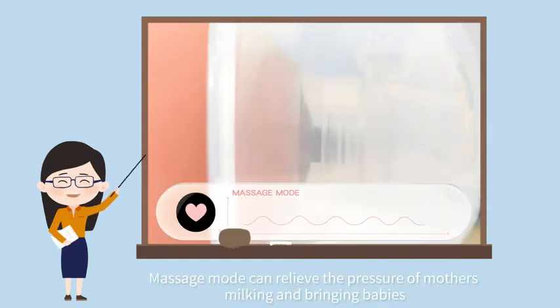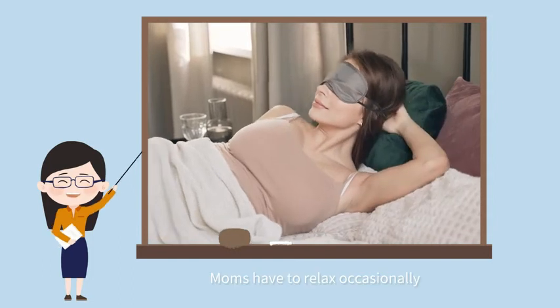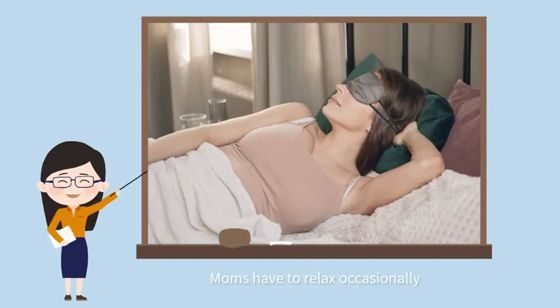Massage mode can relieve the pressure of mothers during milking and baby care. Moms have to relax occasionally.